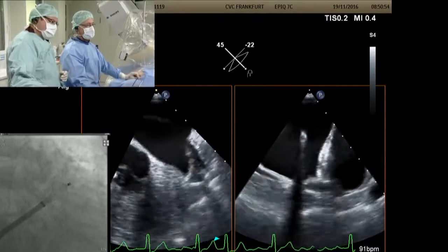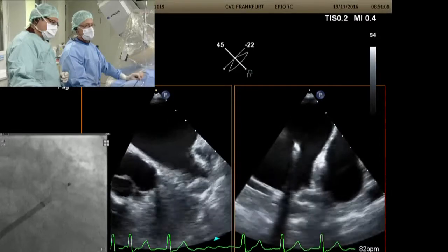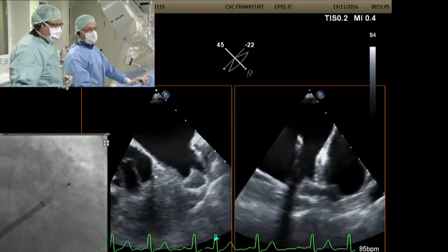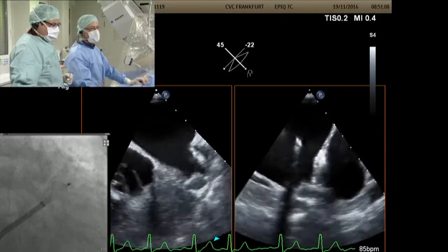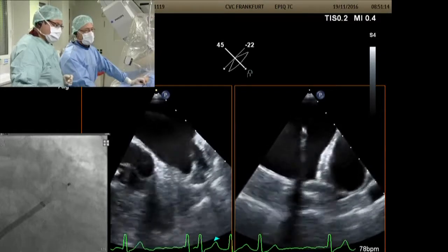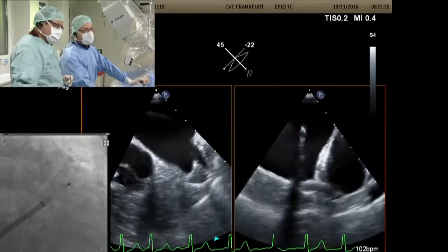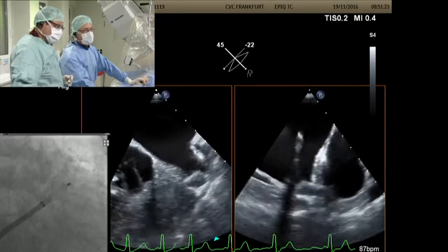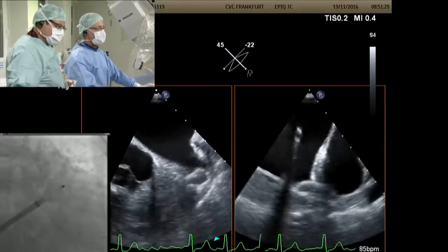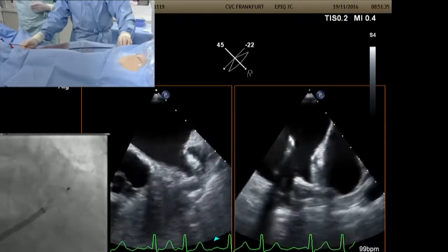I think if you look at the transversal view on echo, it looks quite okay. I will try to expose the lobe and re-evaluate again if it's too proximal or if it's okay. I think in the short axis on the left side of the screen, I agree it looks good. When I look at the right side of the screen, which is the 135 degree, there's some overshadowing by the sheath, but there seems to be a big gap at the inferior edge, right? And this will be the problem here. With the device only half out, I'm slowly exposing it.